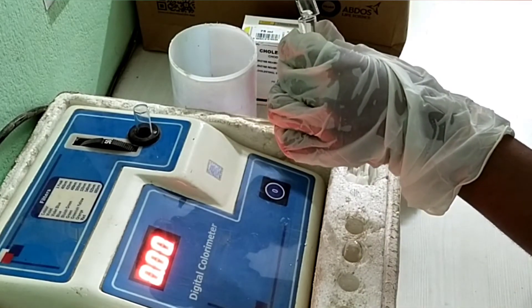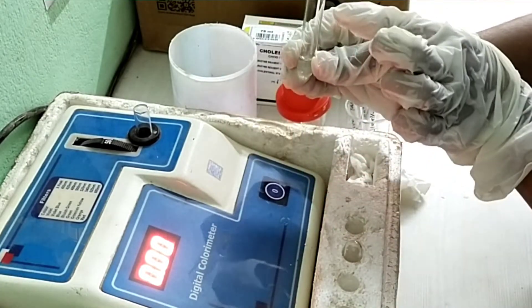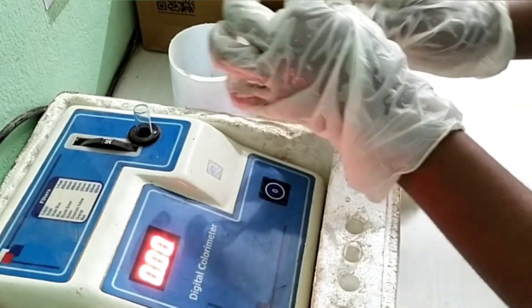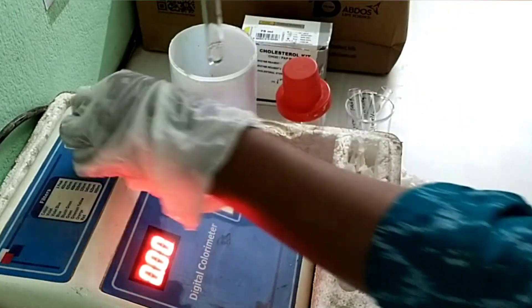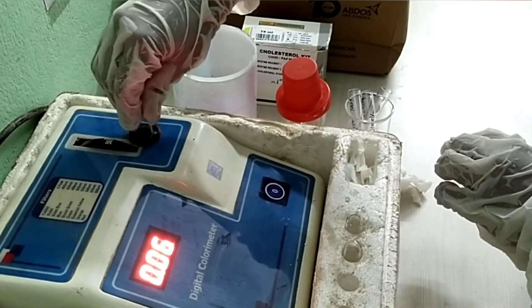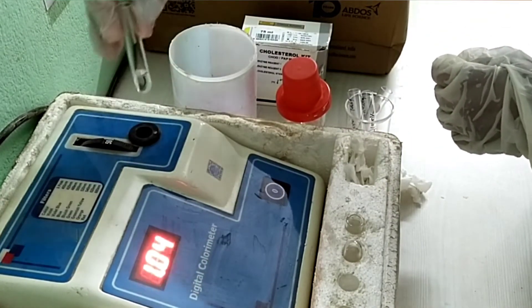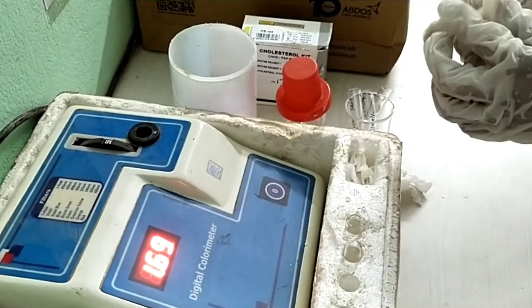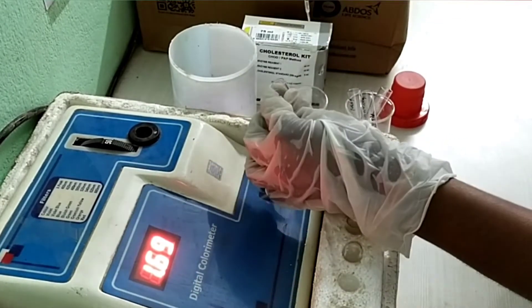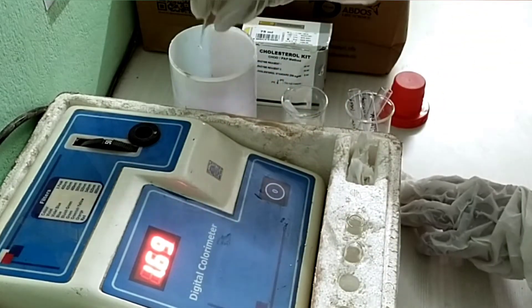Take blank sample reading. After every sample reading, repeatedly clean the glass test tube with distilled water, tapping on tissue paper, and wipe the outer portion with tissue paper.